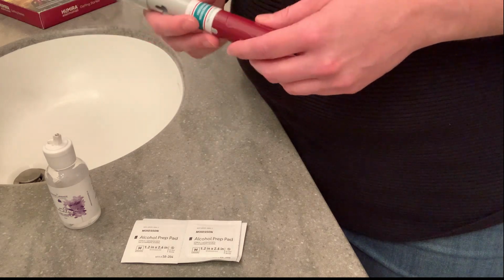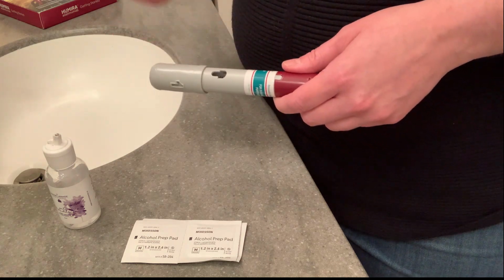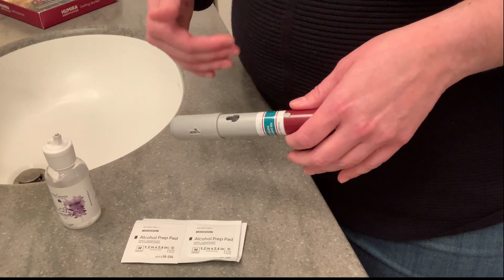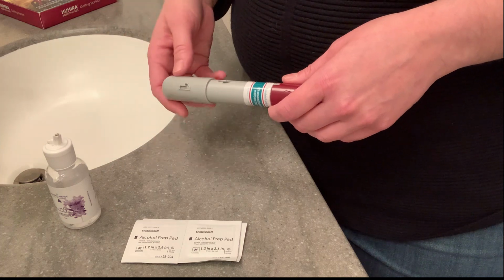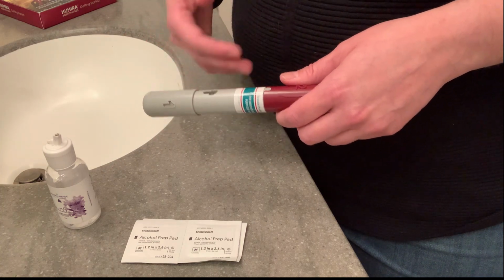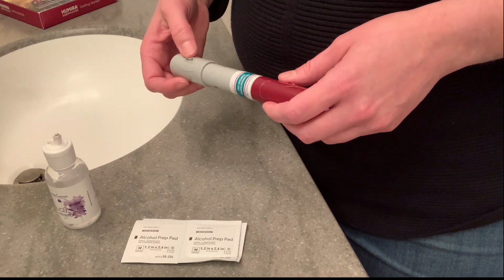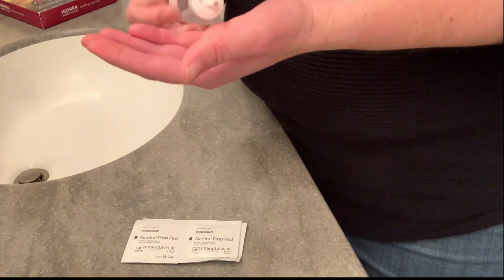And in terms of where to inject, well, typically we inject on the thigh, the abdomen, and if someone else is doing it for you on the deltoid. You want to try to rotate the injection sites as much as possible. And if you're using the abdomen, you want to be at least an inch or two away from the belly button. All right, so first things first, you want to wash your hands.